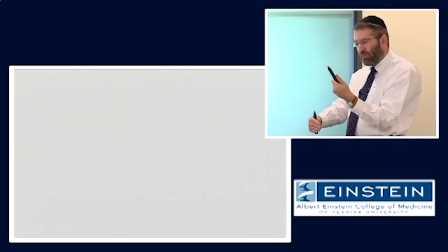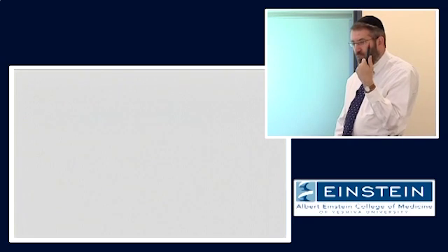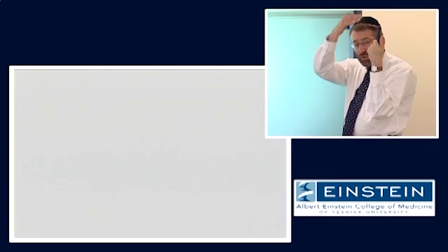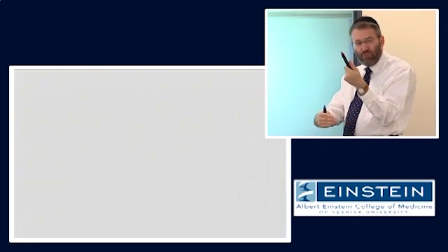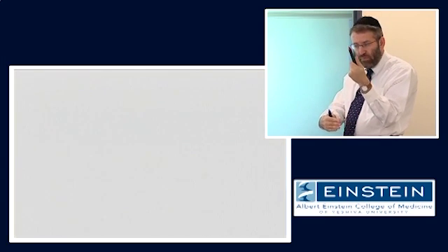Right? Once I put it down to 45 degrees, and now, as we wait and watch this recover, if we wait a really long time, TR, we will fully recover all of that longitudinal magnetization and generate the same amount of transverse magnetization at 45 degrees that we did the first time. Right? We'll be in that same steady state. What if we shorten the TR? If we shorten the TR, well, we won't make it quite all the way back. And when we knock the amount of recovered longitudinal magnetization down to 45 degrees, we will have a little bit less, and with that shorter TR, we will be in a shorter steady state.